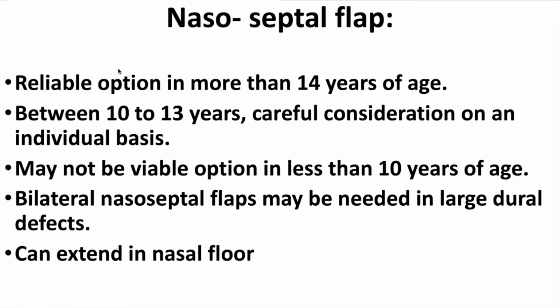So what about the age and the flap? Any patient who is more than 14 years of age, the nasoseptal flap is reliable, but in between 10 to 13, careful consideration should be made on an individual basis.